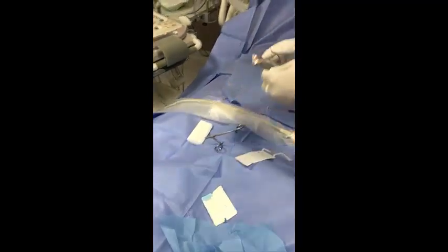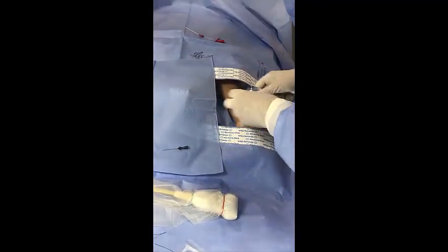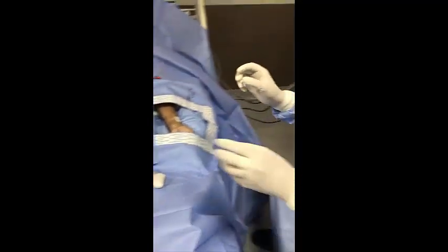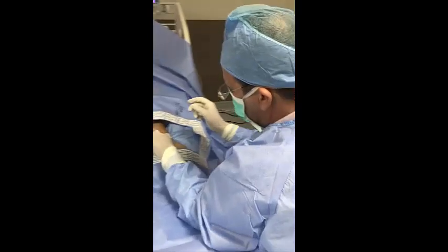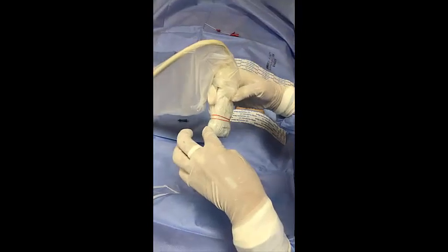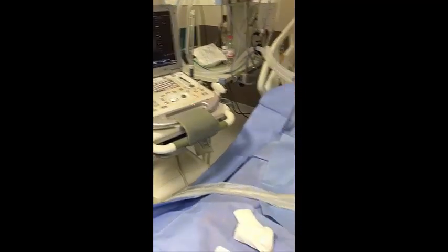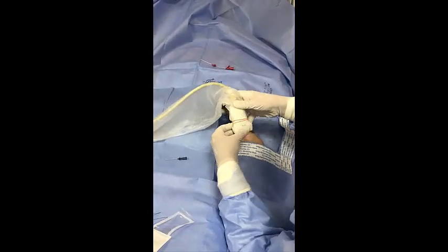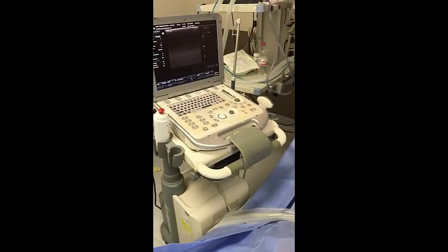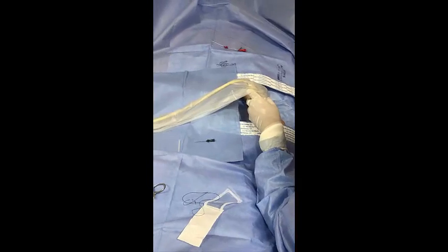I will start to put some gel here — a little gel. I prefer to do it in this way. This is the orientation mark on the probe. I will check here and increase the depth, please — increase the size.